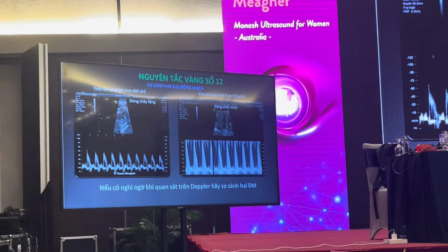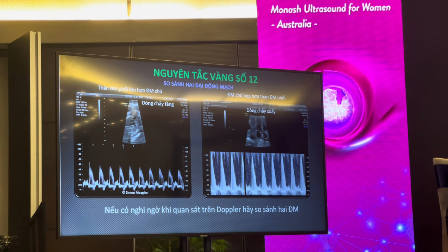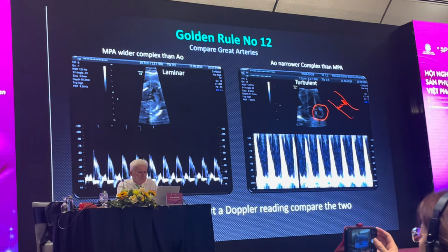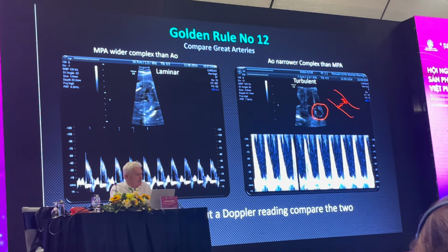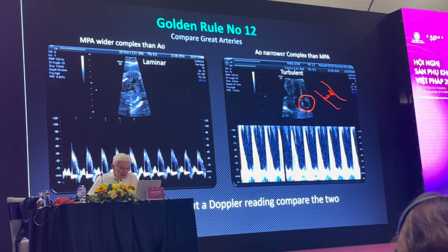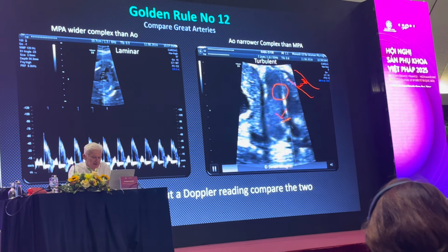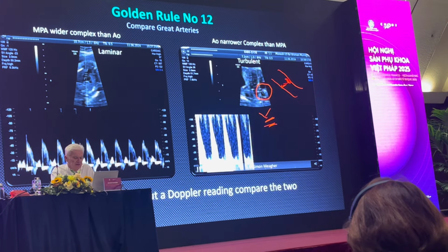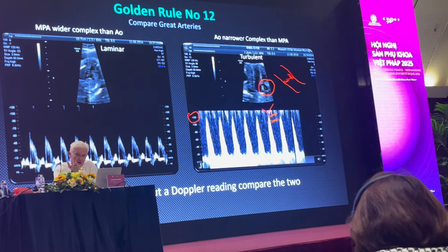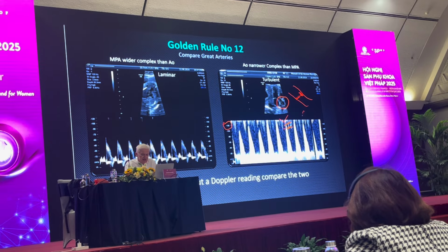So you go to work tomorrow morning in Hanoi, you scan a baby, and you look at the velocity, you see that there is increased color on the left ventricular outflow tract, and the valve looks a little bit thickened. And you say, Simon, I think this baby's got aortic stenosis. What do you think I will ask you to do? I will ask you to put a pulse Doppler gauge after the valve. There's the valve. And then you see my velocities are greater than 100. So I know my 100 rule is broken. I know that these babies' velocities are around 120 centimeters a second.